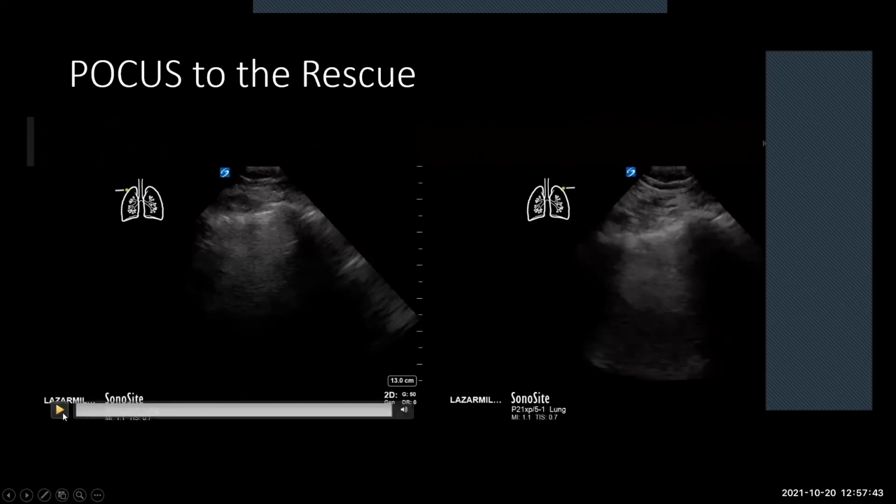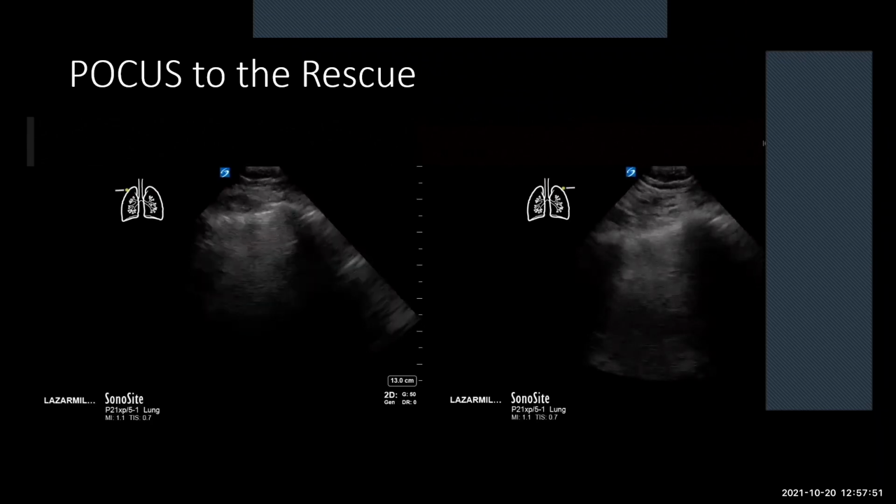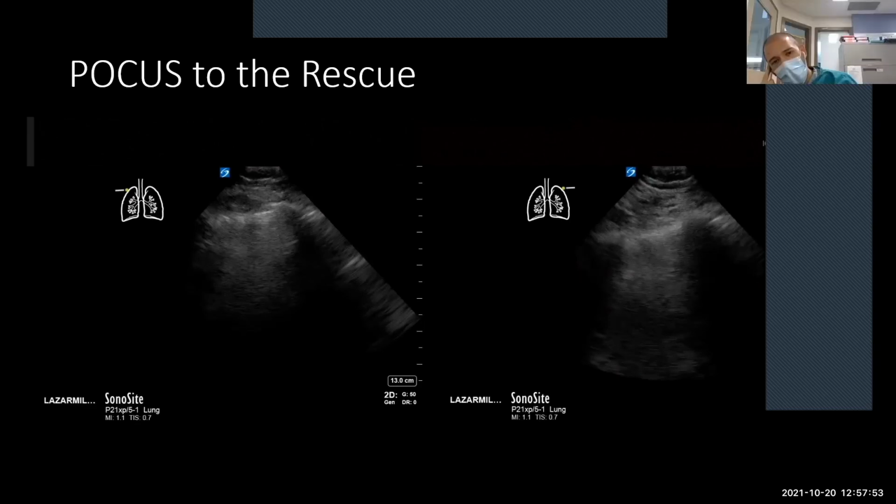Is there a lack of lung sliding on the right side? Yeah, I don't see any lung slide and I don't see any B lines. Yeah. And I want to compare it across the two, but right now I see pleural line. I don't see really any A lines, and you can tell her body habitus is affecting a good image here. These are not particularly good images, but I am concerned there is a difference in the way in which the pleura is moving on the right side.